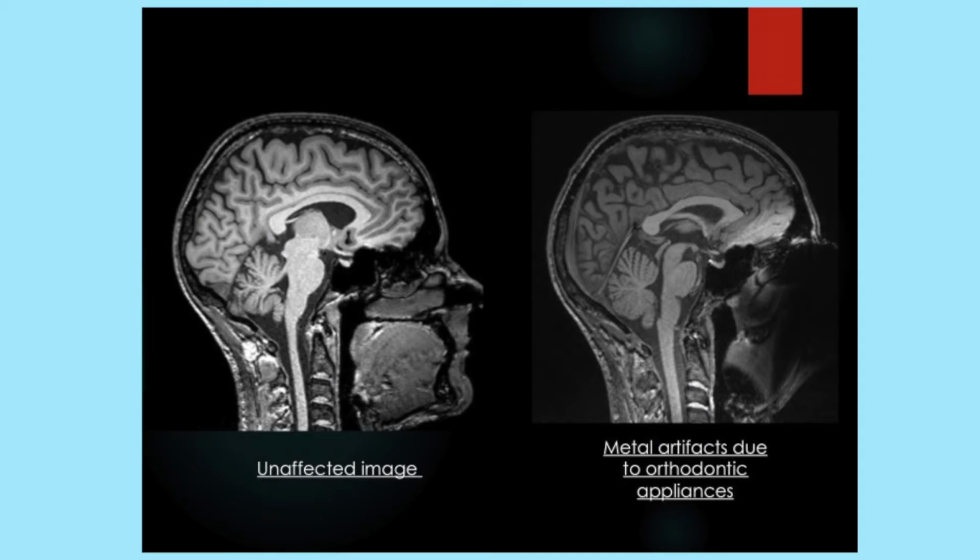Magnetic resonance imaging is frequently used in the diagnosis of a variety of medical conditions. Metallic objects, including orthodontic appliances, can produce artifacts on magnetic resonance images, which are more severe with higher resolution scanners such as 3 Tesla scanners, the current standard of care.